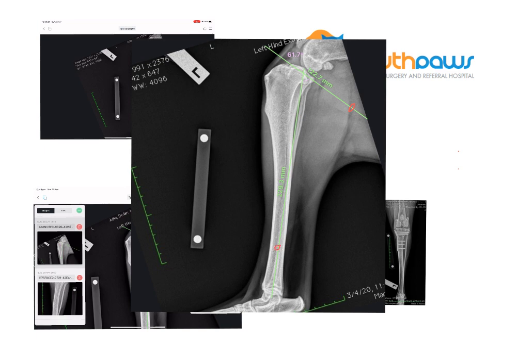We're going to put a line on the long axis of the tibia, which goes from the intercondylar eminences all the way down to the center of the talus. Then we're going to put our tibial plateau line, looking at our landmarks on the cranial aspect of the tibial plateau and the caudal aspect of the tibial plateau — a little indentation of the cranial aspect that we aim for. The angle between these two lines is 61.7 degrees.